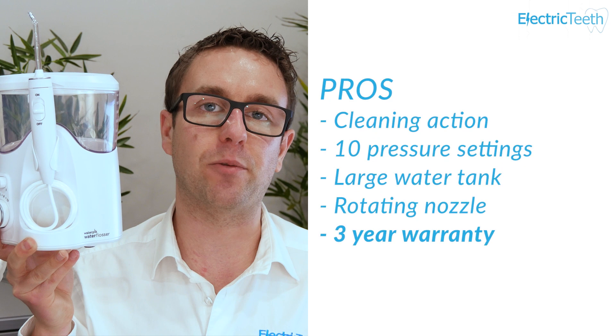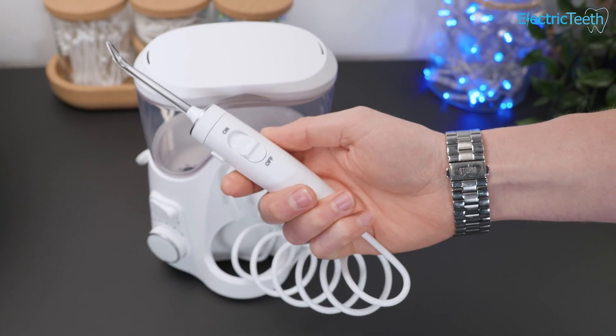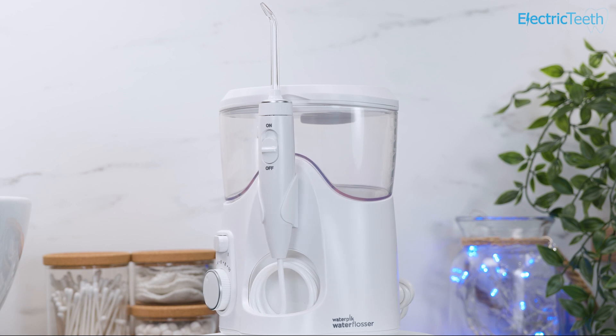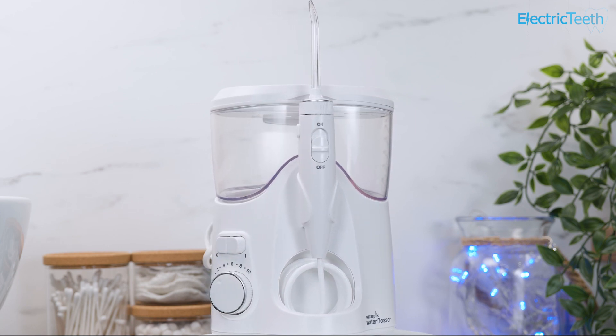The final pro has to be the fact that this comes with a three-year warranty. It's pretty common for electronic products to come with a two-year warranty, but that extra year really adds peace of mind. It shows that Waterpik have confidence in their product, and that extra year just adds extra value to the overall package.